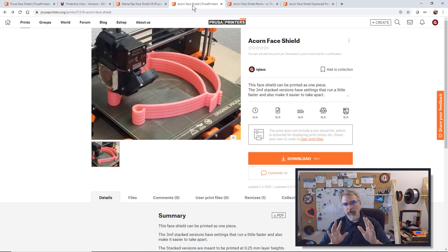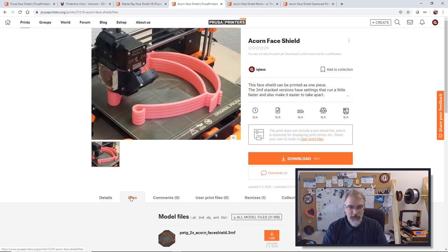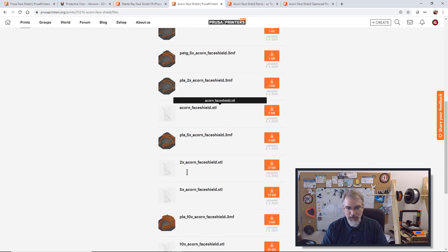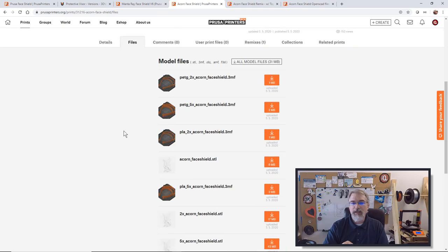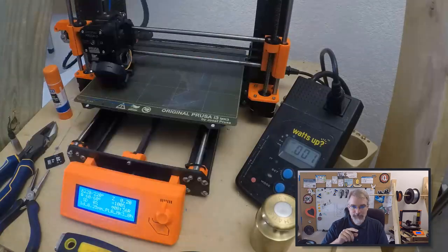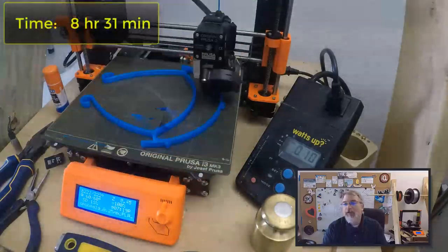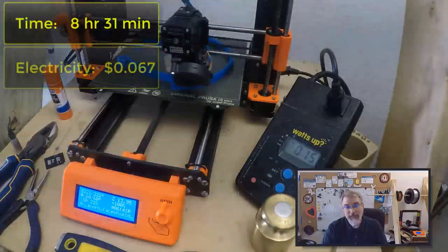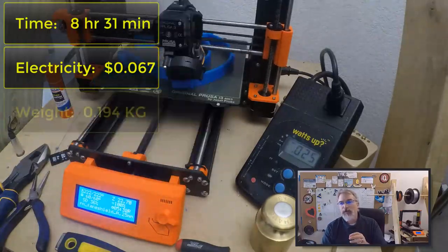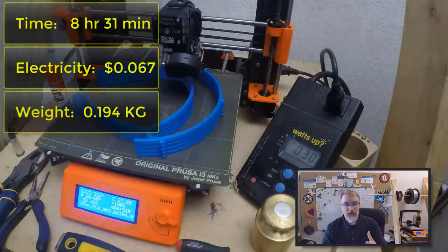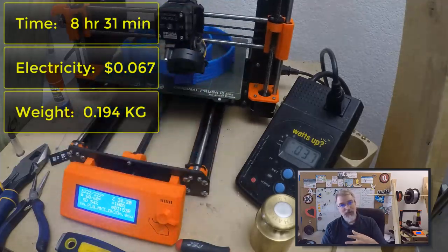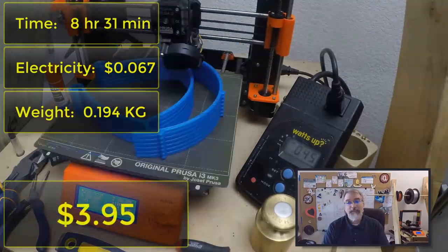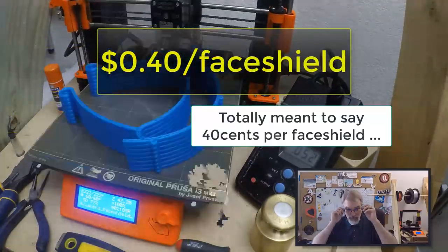Now with that, let me go over the numbers real quick. So over here, if you go on the first one I printed, there are some 3MF files here. And the 3MF files, there's a 2, 5, and a 10 for PLA. Now for the 10 PLA, let me go over the numbers. The 10 PLA took 8 hours and 31 minutes to print. It took 6.7 cents electricity and it weighs 0.194 kilograms, which comes up to $3.88 worth of material. So total cost $3.95 to print 10 or roughly 40 cents per face shield. So not too bad.